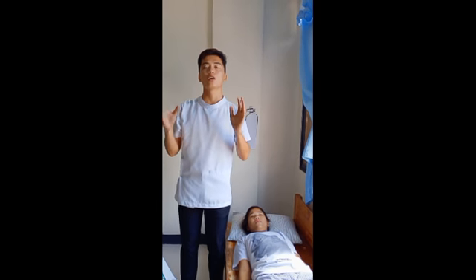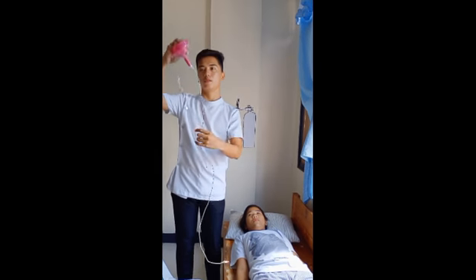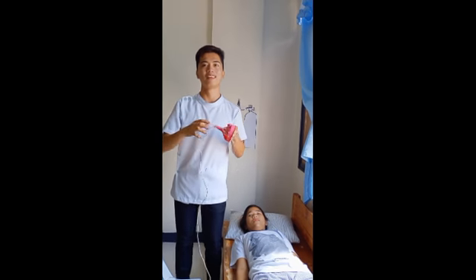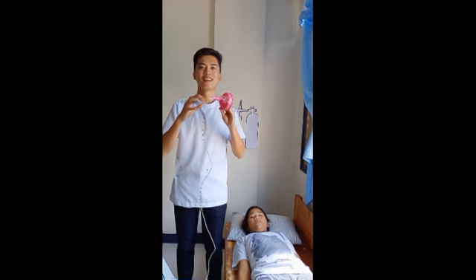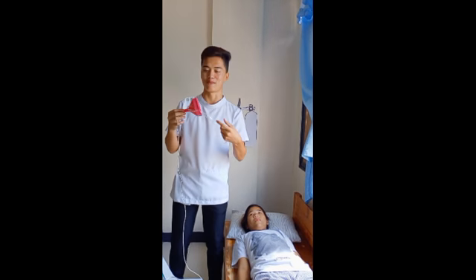The next is I'm going to provide the simple face mask. So what is the simple face mask? The simple face mask is recommended for high concentration of oxygen, providing 6 to 10 liters per minute. So this is the simple face mask.